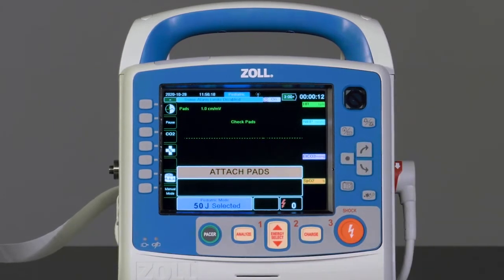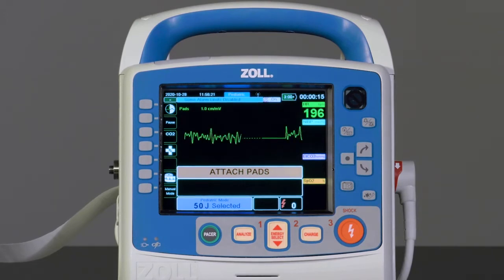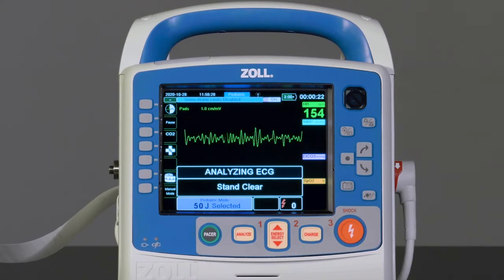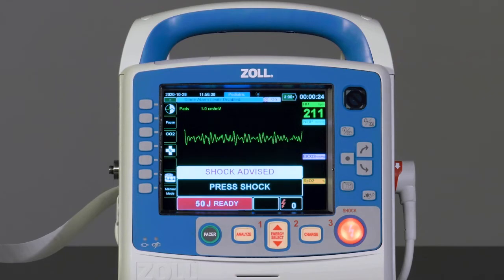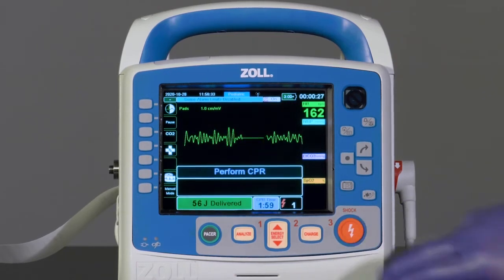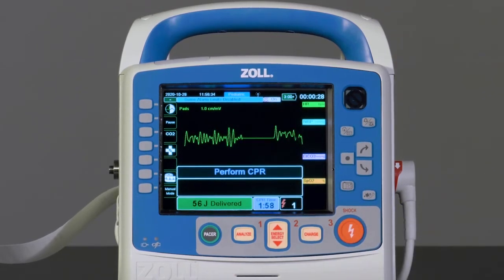Attach pads. Stand clear. Press shock. Perform CPR.